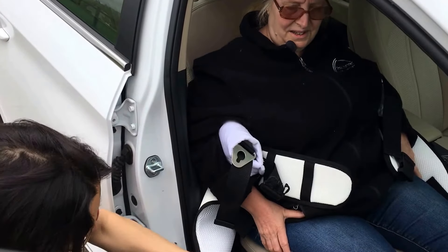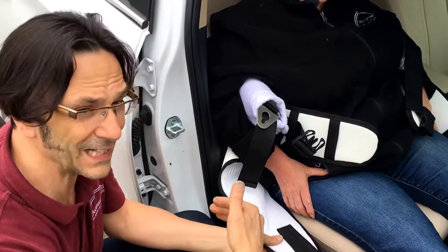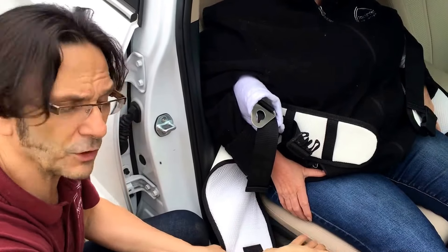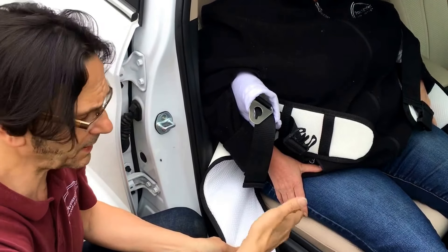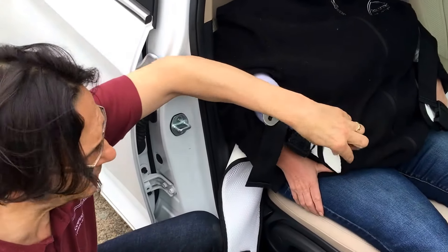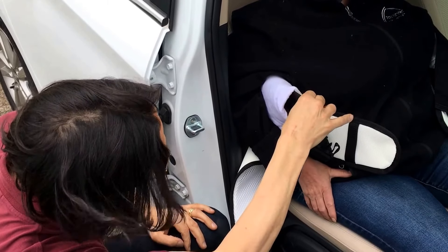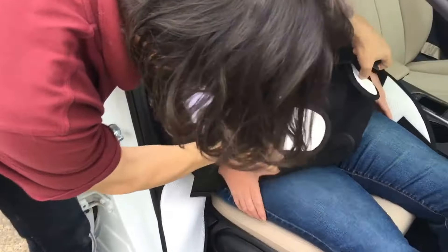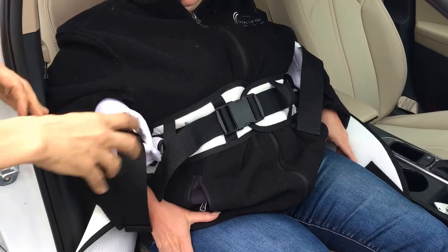So the combo sling — when do we use a combo sling? Use a combo sling when you need to transfer somebody, but then at a separate time you need to lift them up just a little bit by the torso only, in order to be able to change clothing, pull the pants down, change a diaper, or basically just shift a person's position. The combo sling is usually built in a bath version, because typically it's used for bathing. It has a very heavily padded band right under the arms — very short, very stiff padding — and we also have a chest compression band that we use to spread the load out so we're not just putting all the weight under the arms.